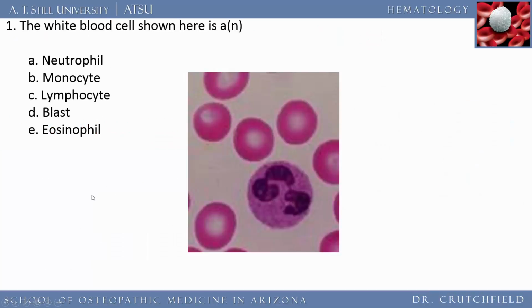So let's take a look here. The white cell shown here is blank, and I'll let you go look that up. Let me go through these. I'll shut up. I'll let these play for 5 or 7 seconds, and then you write your answers down and go check them with the PowerPoint.